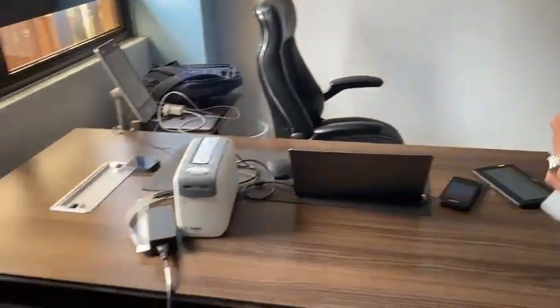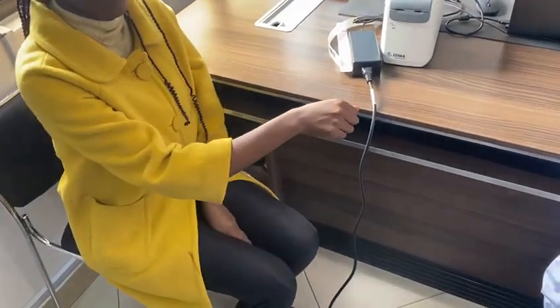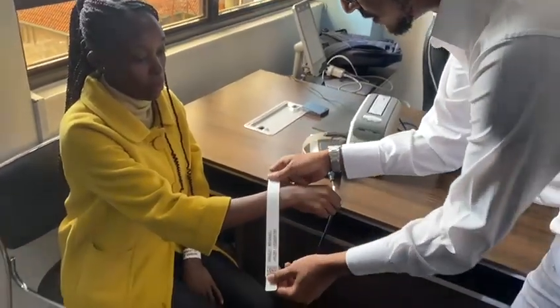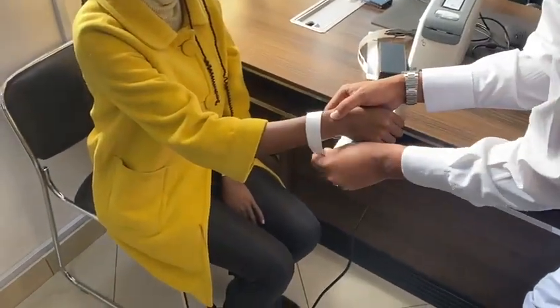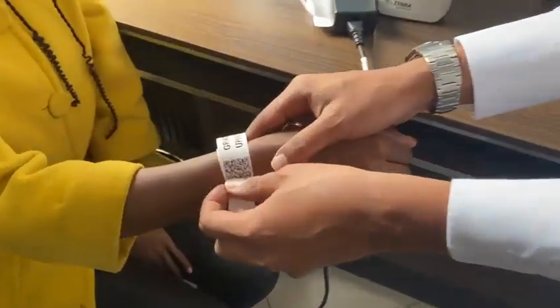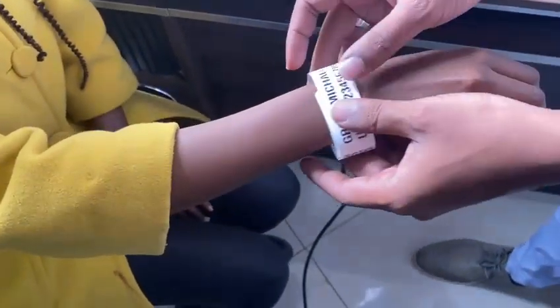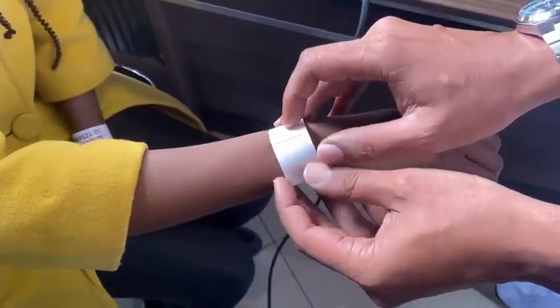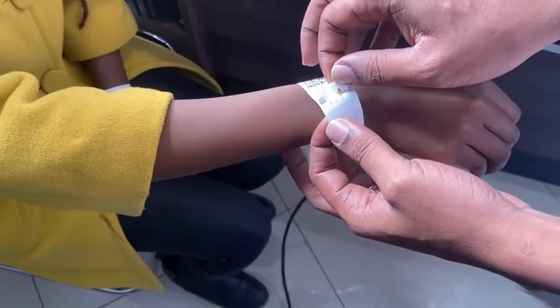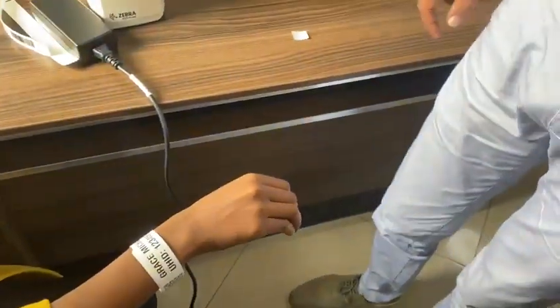sit down. This is the place where we are meeting our patient, our volunteer today. So what happens is, we are going to just put the wristband at the point where she's comfortable. It doesn't have to be very tight. And you can see, if you're admitting this patient, you cannot even remove it. If you want to remove it, you see it is tearing apart. And then we can say, now she's ready for admission.